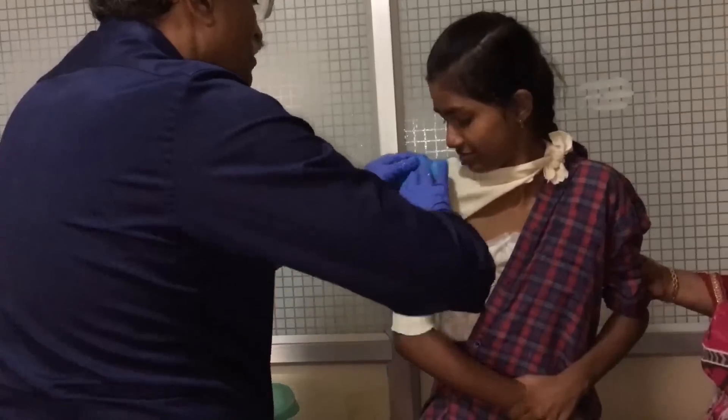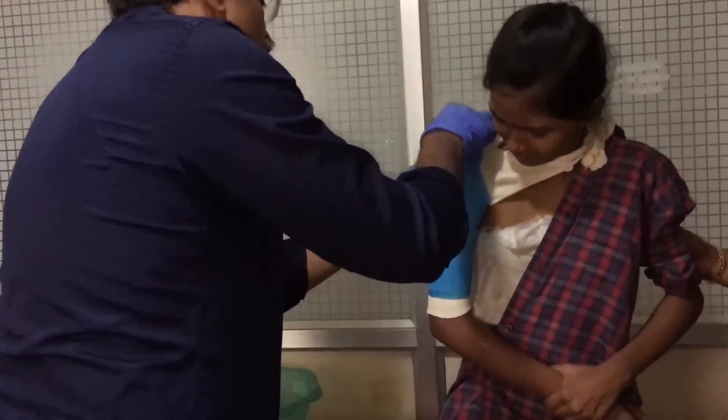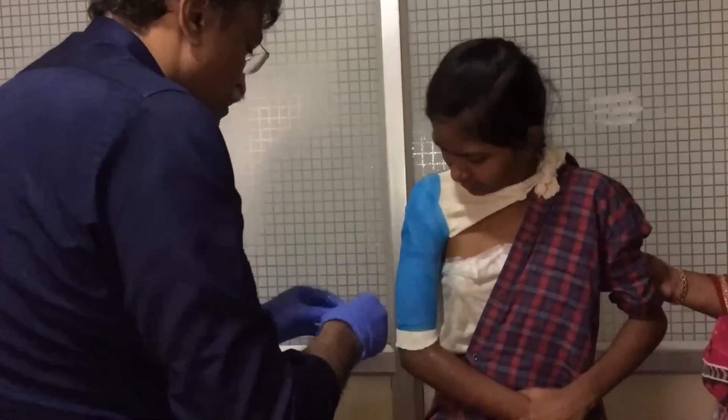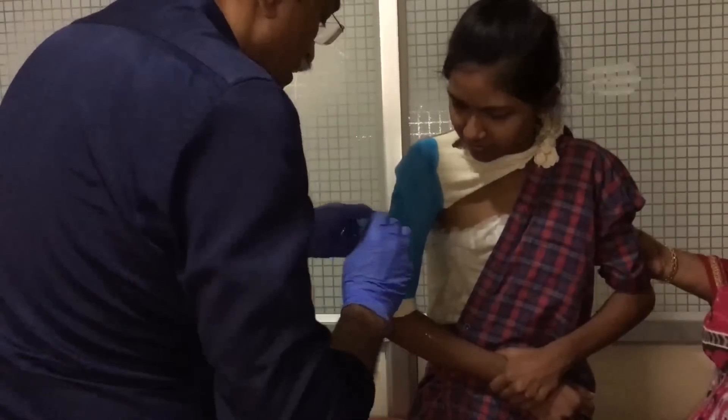The patient was in agony when she first came because of the non-reduced fracture. However, the instant the fracture is reduced it becomes relatively pain-free.